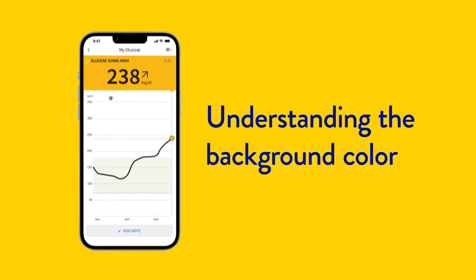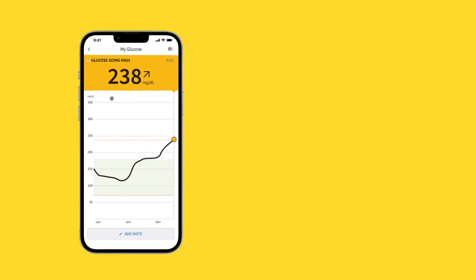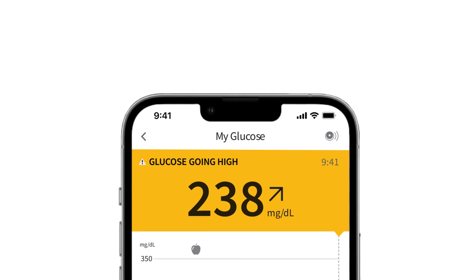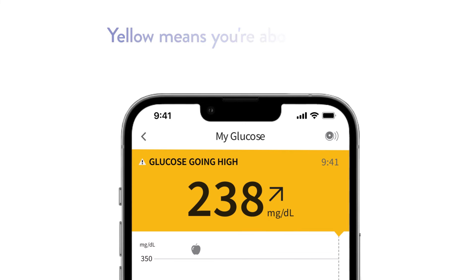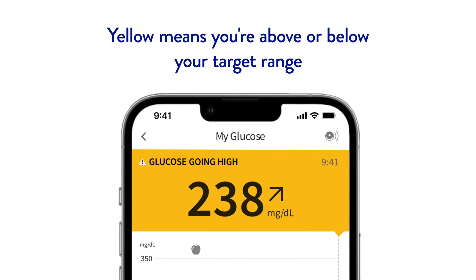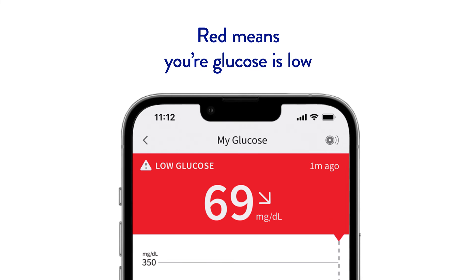You will also notice there are different background colours when using the app on your phone. Your current glucose value determines the background colour. Orange means your glucose is high. Yellow means you are above or below your target range. Green means you are within your target range. And red means your glucose is low.